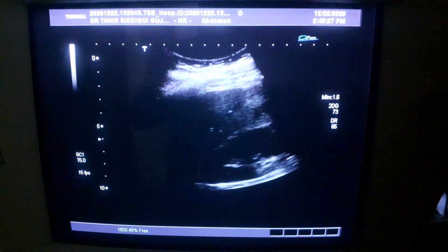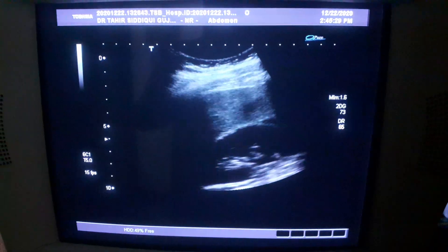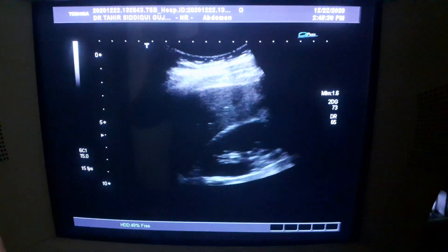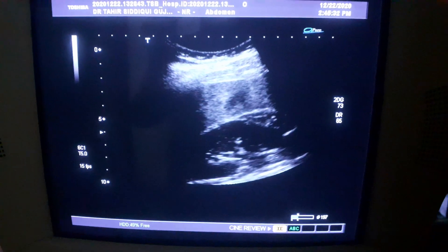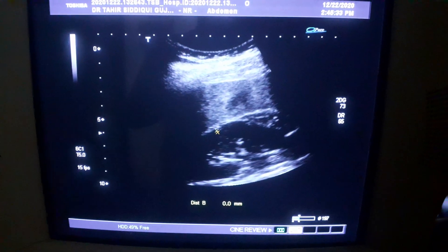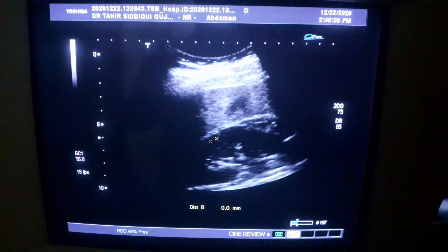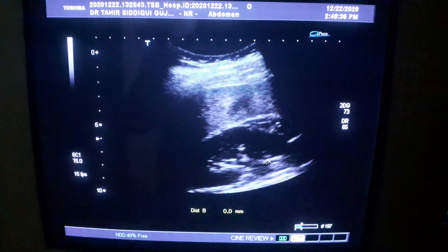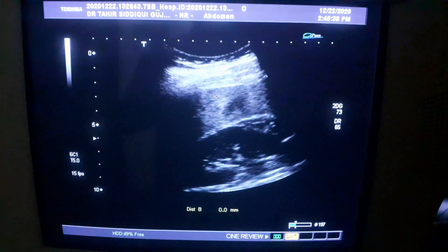This is an ultrasound showing the kidney and the liver anteriorly. This is the right kidney in longitudinal section, and this is the part of the liver.